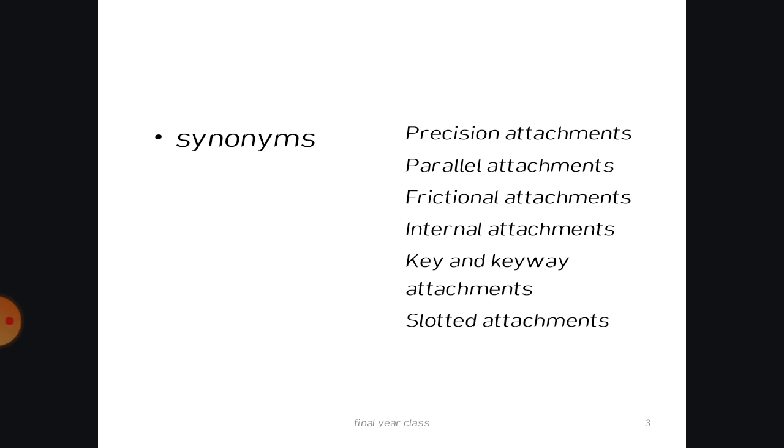One part will be engaging into the prepared tooth or the abutment which receives one part, and the other part will be incorporated onto the denture. So there is a mutual mechanism by which it is being held together. That is why it is called attachment retained denture.